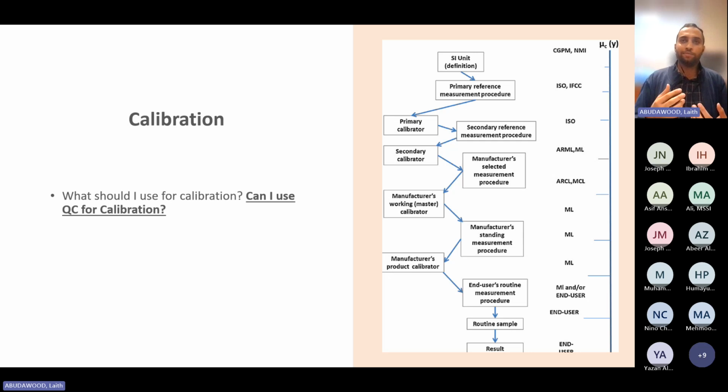Actually, the reason calibrators are significantly more expensive than QCs is that linking your calibrator, making it traceable to a WHO standard, is a very expensive procedure. It's not expensive just because Stago or Siemens or IL want to make it expensive. It's very expensive to buy these references.